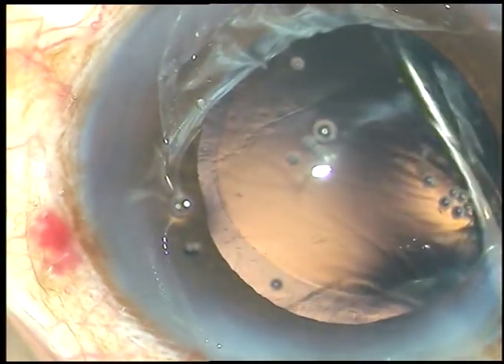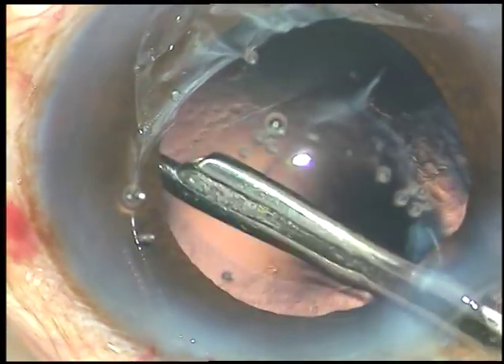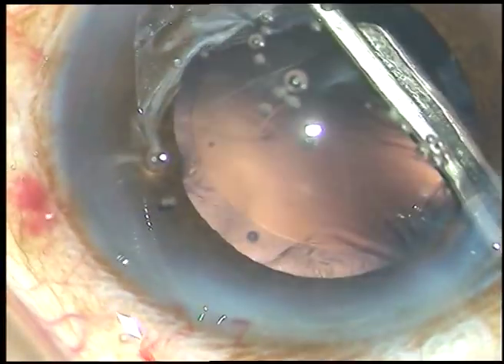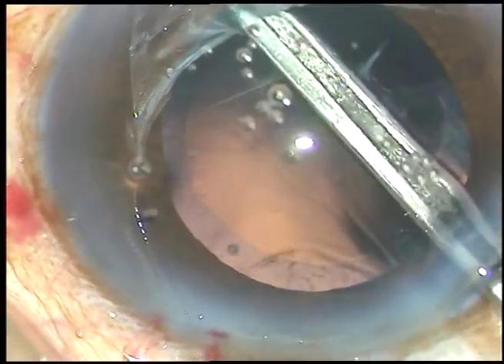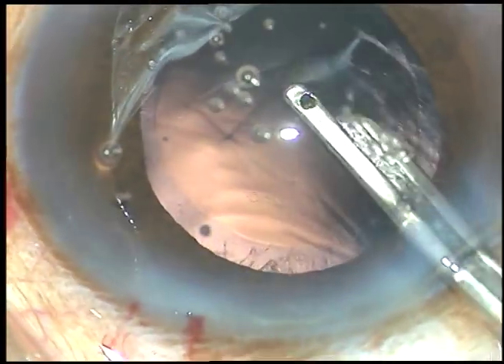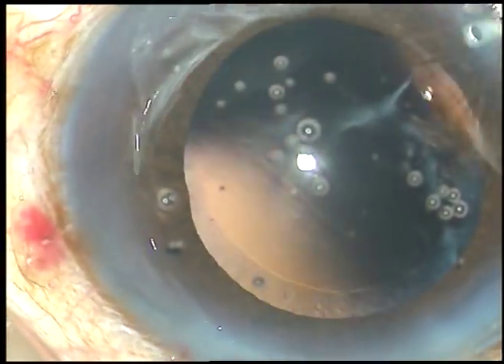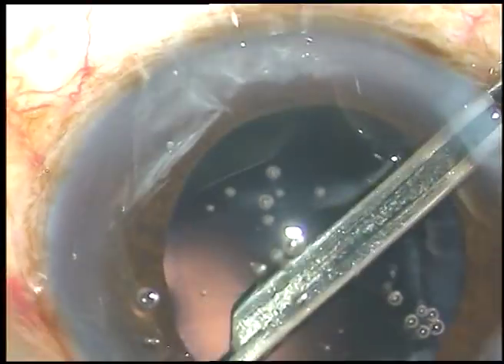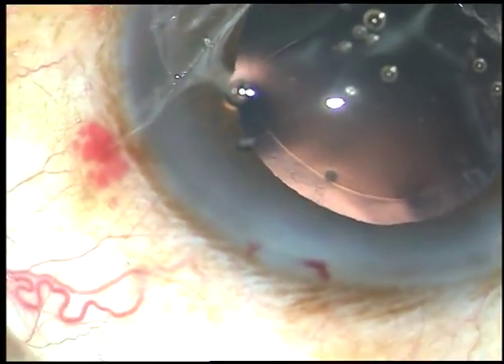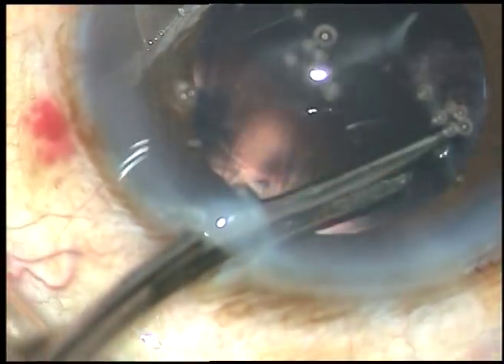Now, very little cortical matter is there in this case because it was a hard nucleus — the epinucleus and cortex were almost incorporated into the nucleus. However, whatever cortex is there, it is removed. You can use whatever you want: bimanual IA, coaxial IA, or this very simple Simcoe cannula.